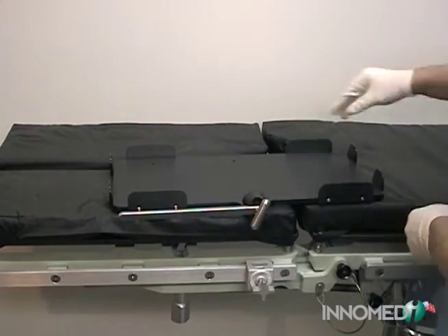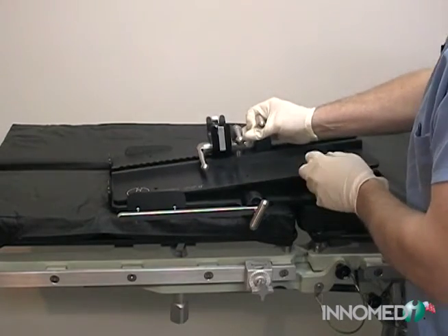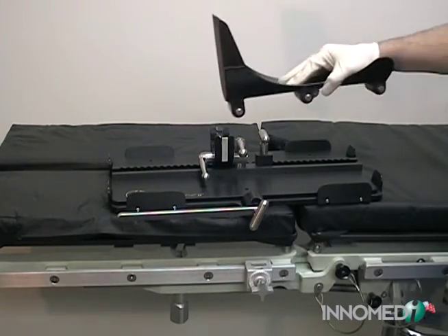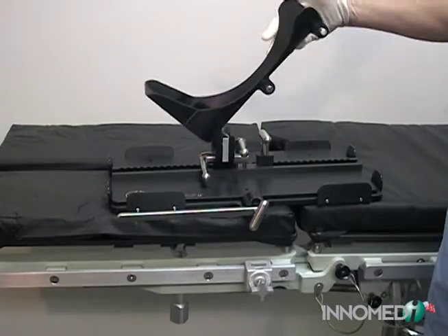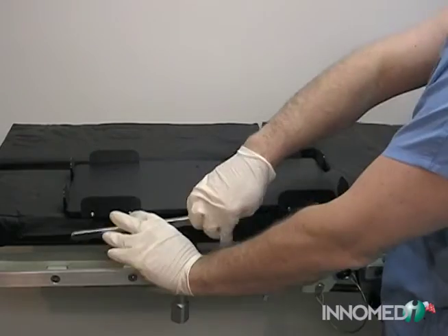The device consists of three separate elements: the base plate that attaches to the operating room table, stabilizing the support plate; the support plate containing the adjustable yoke and track system; and the foot support that interacts with the yoke of the support plate.